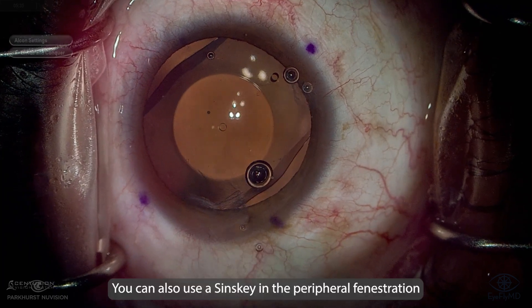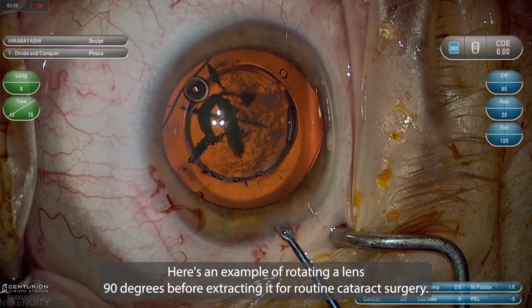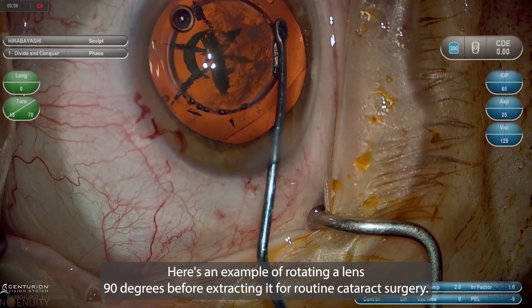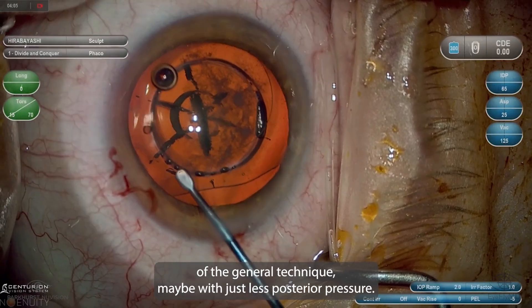A key here is avoiding any posterior pressure that would contact the lens. You can also use a Sinskey hook and the peripheral fenestration to keep spinning, but obviously be extra cautious of the lens capsule. Here's an example of rotating a lens 90 degrees before extracting it for routine cataract surgery. Normally they don't need to be rotated this much, but it's a good example of the general technique, maybe with just less posterior pressure.